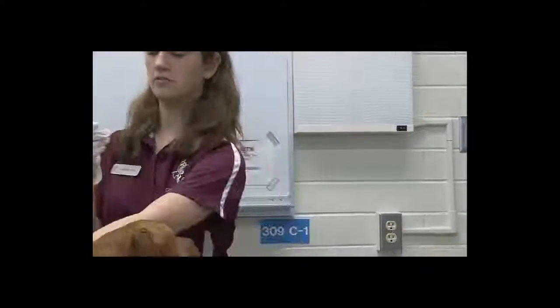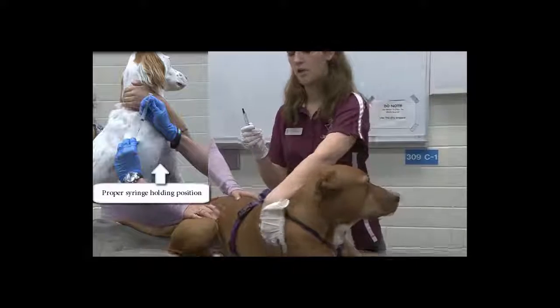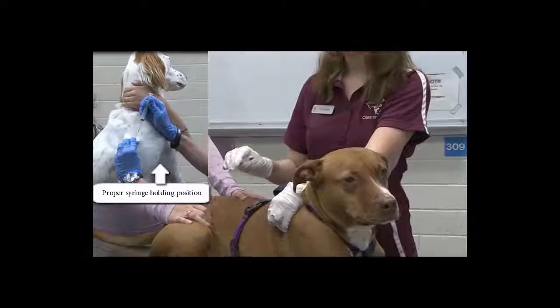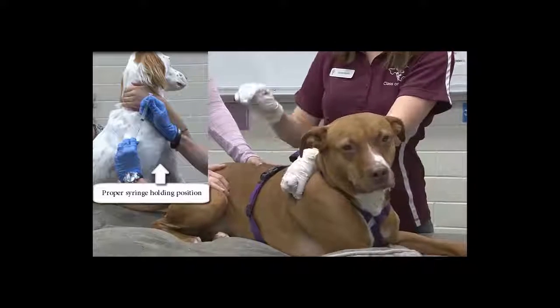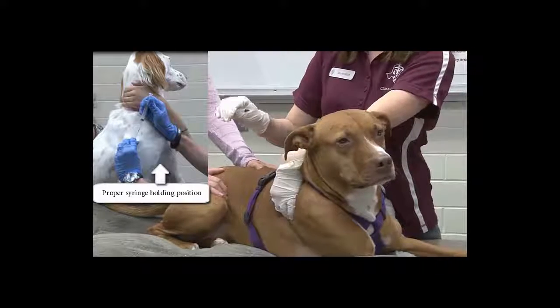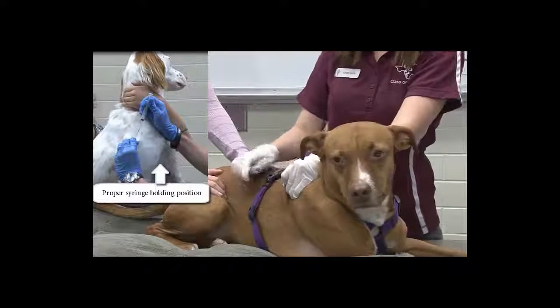So now we're going to lift the skin over the shoulder — not in between the shoulders, but over the scapula. You can kind of make a tent like this. You want to be parallel to the back, and with the bevel — which is this little point — down. So then you make this tent, so you've got kind of a triangle shape. You'd inject it in.